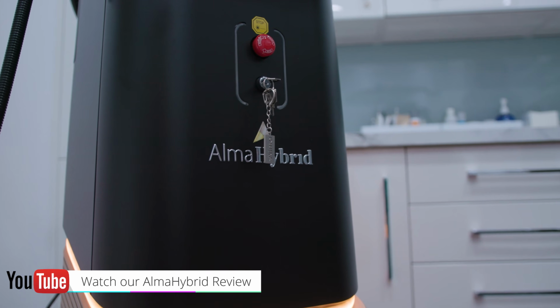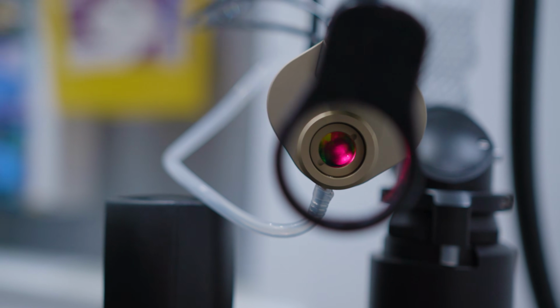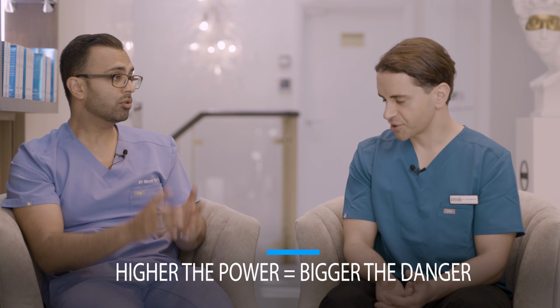Among the high-powered ones, you've got some, like Lumenis, which are around 50 watts. Then the standard CO2 ones are up to about 30 watts, and some of the cheaper CO2s are around 20 watts. They don't have enough power. So the higher the energy, you could argue, the better the result, but also the more dangerous.